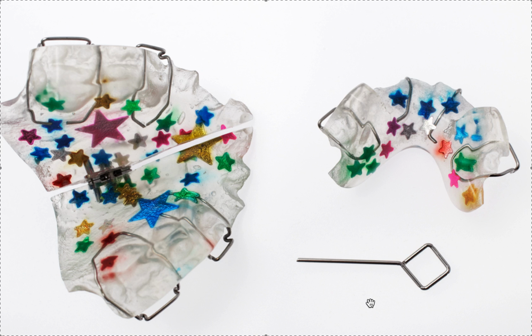But Invisalign with MA is actually idealizing the teeth and straightening the teeth at the same time as growing the jaw. So you're saving a heck of a lot of time. And the compliance is way better because it looks like Invisalign from the front. It feels like Invisalign everywhere. So the patients aren't as embarrassed about wearing them because they're not going to talk funny in them. So I think you get better compliance.